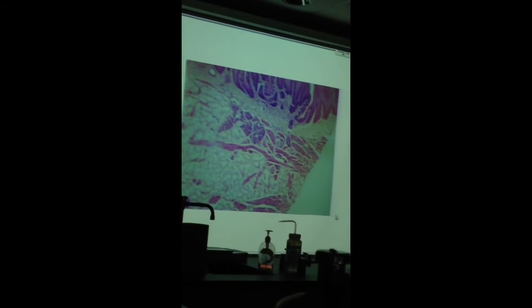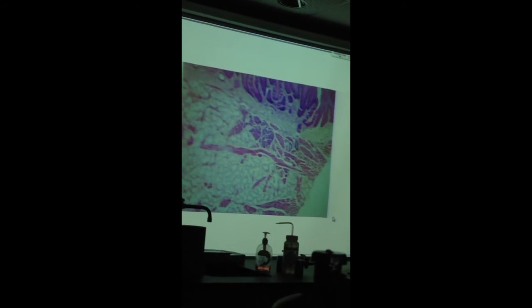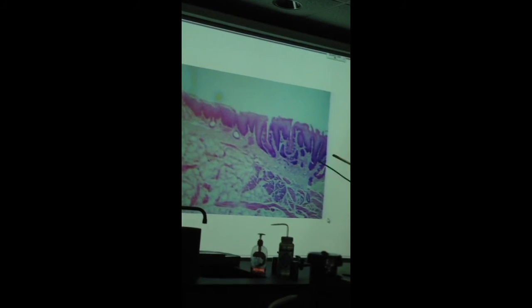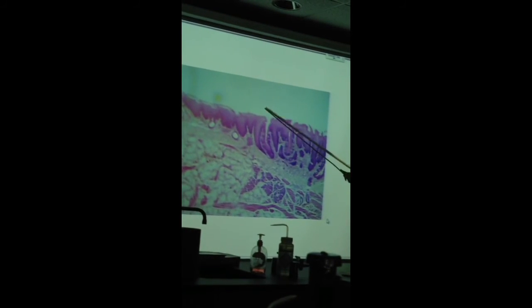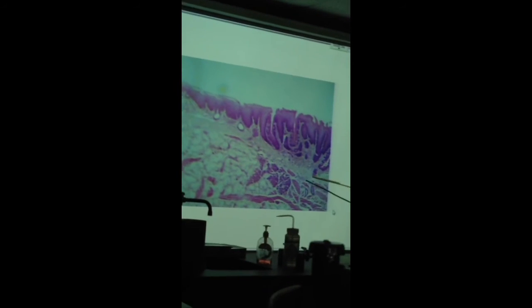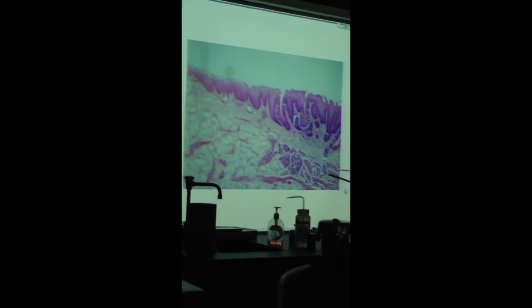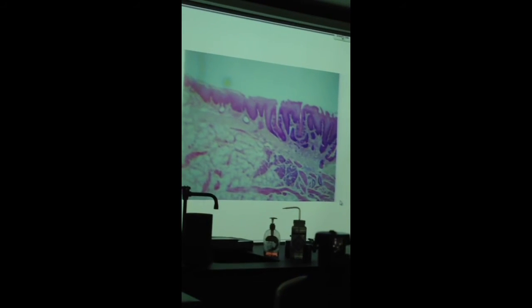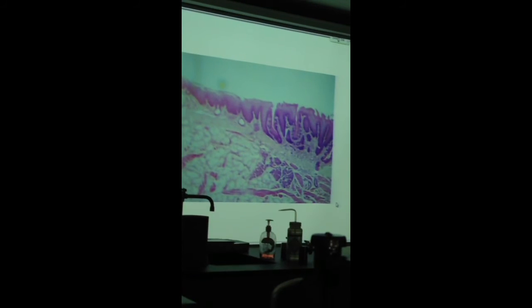Again, overall, you can see the epithelium here at the top, the side. Here again, you can see the fungiform papillae. There's one of the filiform. Here again, the dark stained cells are serous cells. The lighter stained cells, mucus cells. And this, of course, would be something else again. So these are things you'll be able to pick out in these sections of the tongue. Any questions?